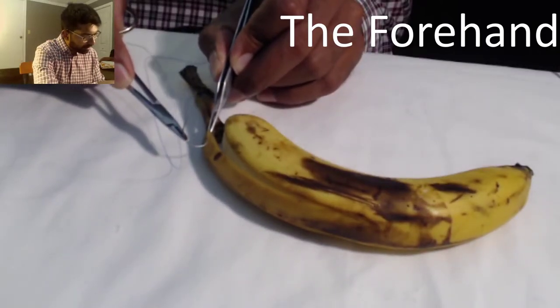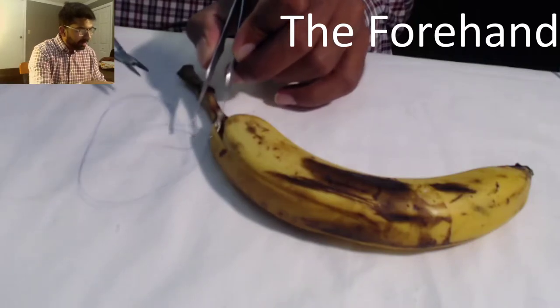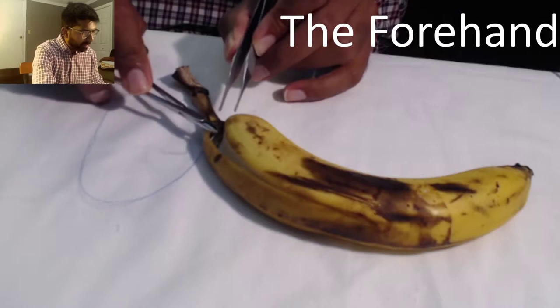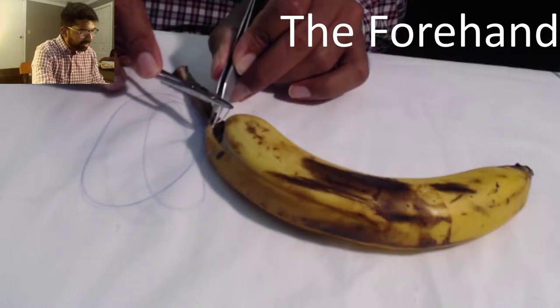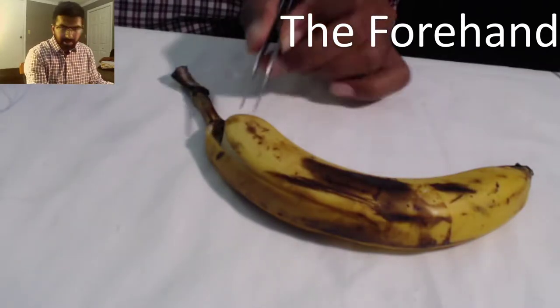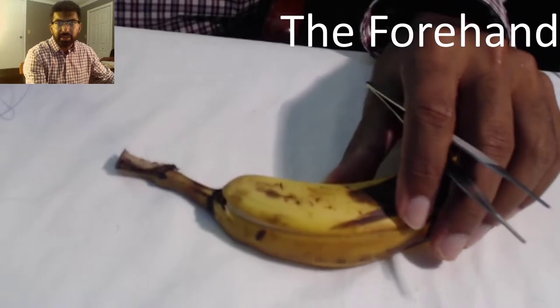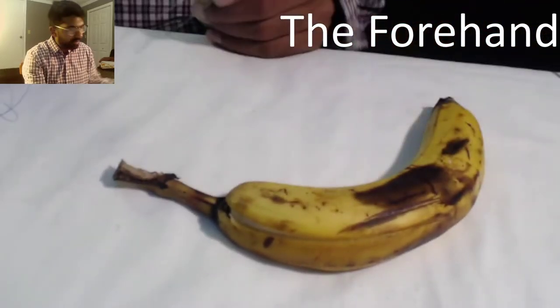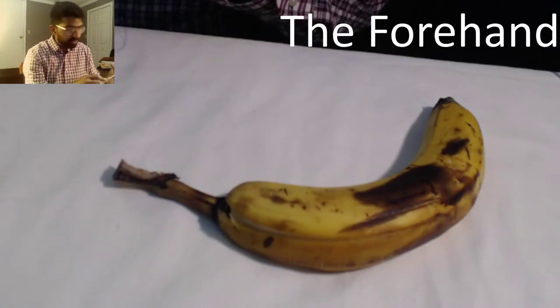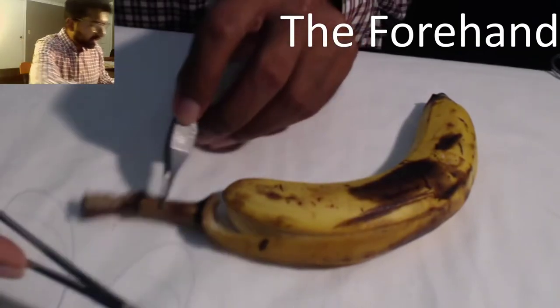We're going to do a couple things right and a couple things wrong. I've taken this bite. Now you notice, if I just go and pull the needle out without using the curve of the needle, it actually tears through the banana peel. That portion of the banana peel is now no good — it's a tear. You will actually tear tissue if you use that same technique.